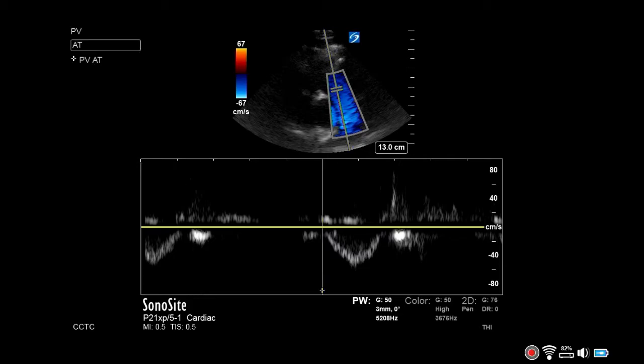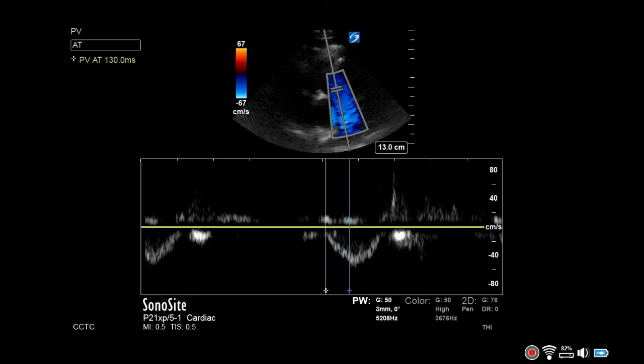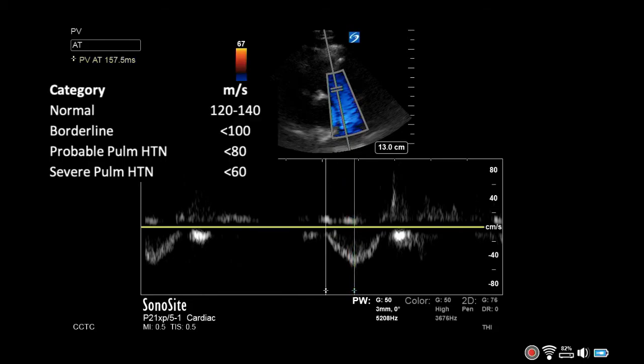Place the first time marker at the beginning of systole and the second at peak systolic velocity. The difference between these two points is the pulmonary acceleration time.